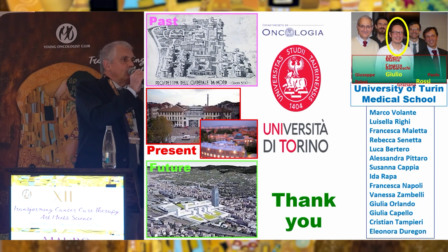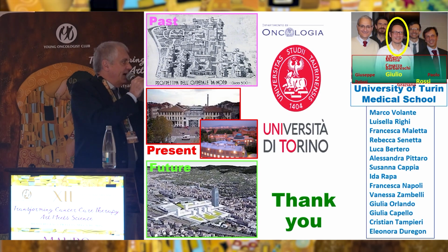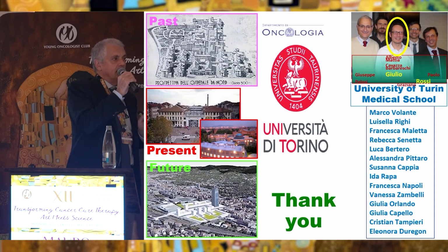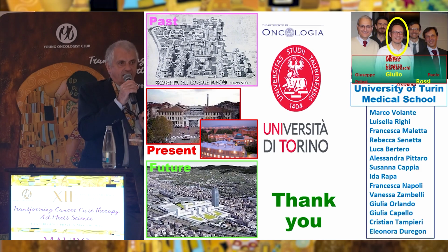Since the machine was taught to recognize small cell lung cancer based on the crushing artifact of the small cells one together with the other, if you have a large cell neuroendocrine carcinoma or a carcinoid, which due to the surgery has been suffering some crushing artifact on the border, the machine calls small cell lung cancer a carcinoid, which if it was my tumor, I would not be happy of that. So the machine is okay, but please check it. Thank you so much.